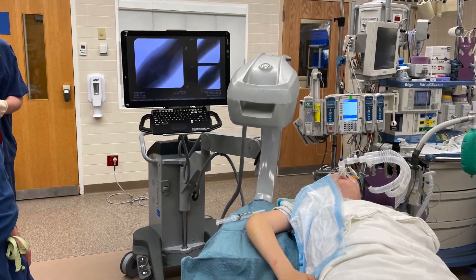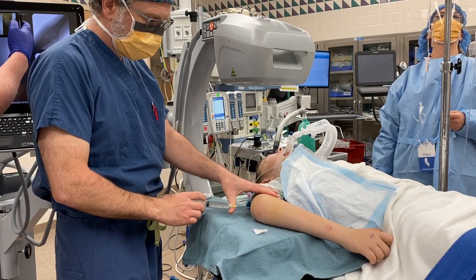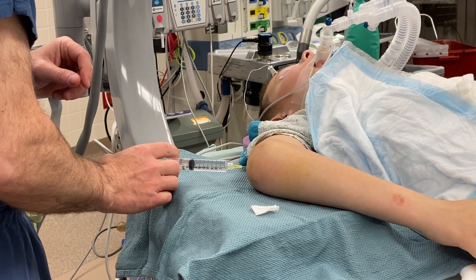The first step in treating the patient is to determine the type of fracture that the child has sustained. An arthrogram is performed in the posterior portal to see if the fracture has reached the articular surface. The joint is injected with half-strength contrast dye.